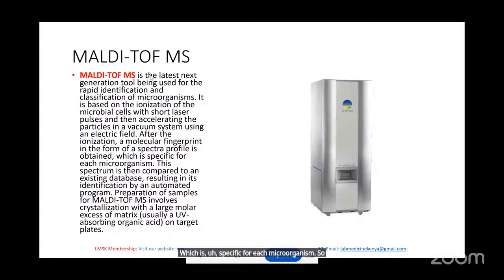This spectrum is then compared to an existing database, resulting in its identification by an automated program. Preparation of the sample involves crystallization with a large molar excess of matrix on target plates. So that's basically how MALDI-TOF MS works.